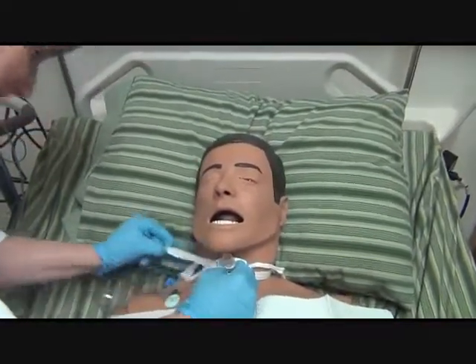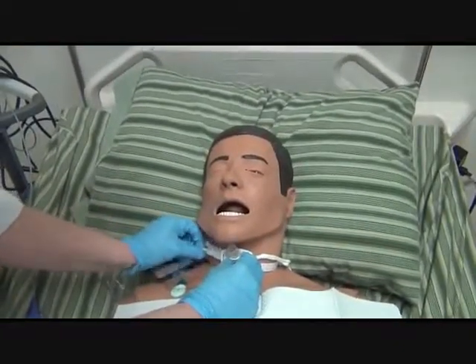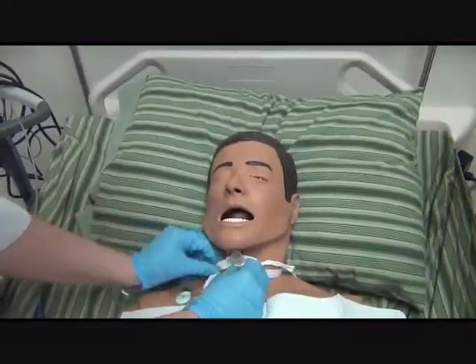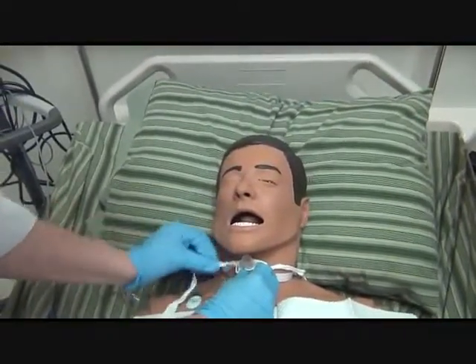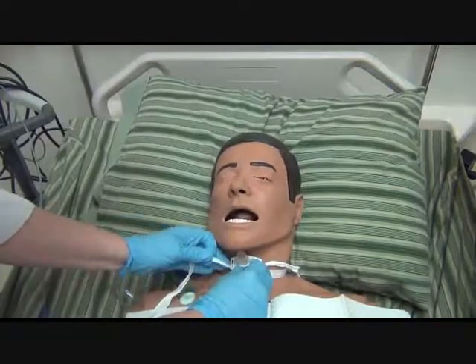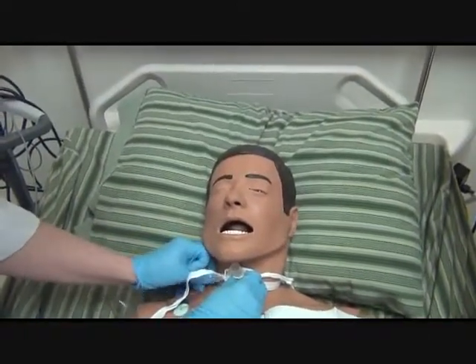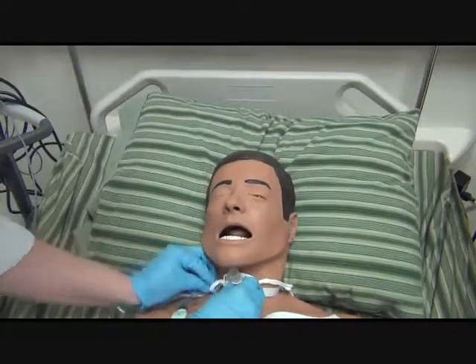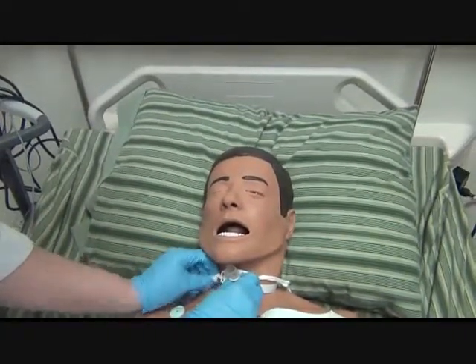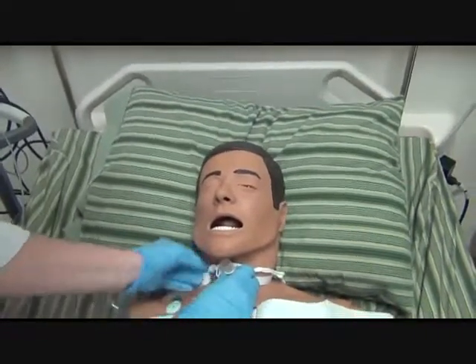Snug that up. You want to run one finger under and have a one finger breadth under there in terms of tightness. That way you know that it's not going to be coughed out.